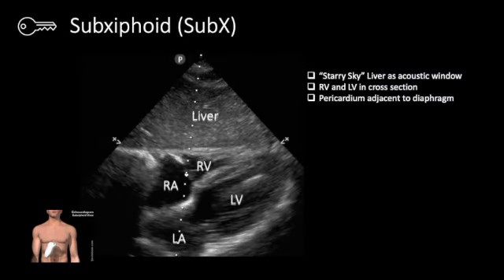Here is a still image of the subxiphoid view that was obtained in an emergency room evaluation. About half the time that you see a subxiphoid view, you'll see this view with the probe indicator marker on the left side of the screen. This can be due to the machine presets, but also it's because it's a standard view of the FAST exam, which typically starts out using an abdominal preset on the machine and often doesn't change to use a different mode or a different probe, in order to quickly evaluate a patient without having to fiddle with the settings on a machine.